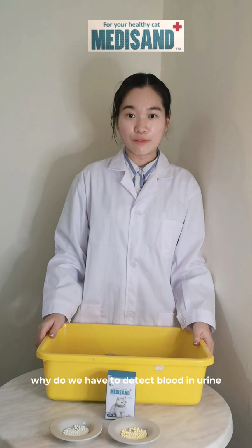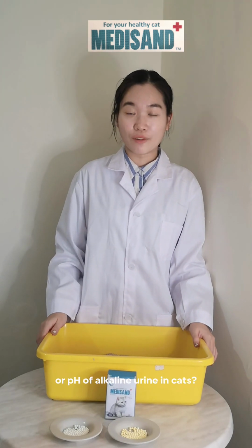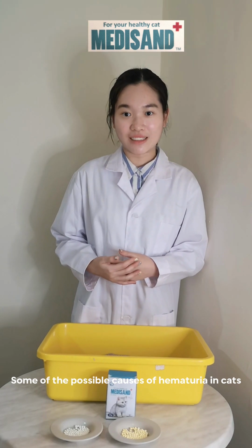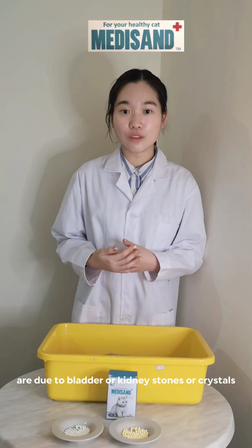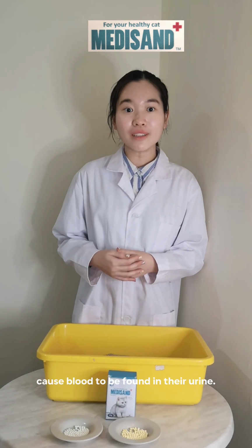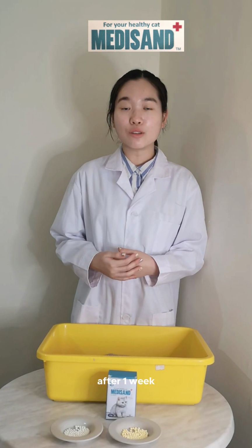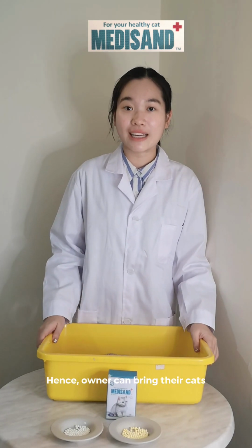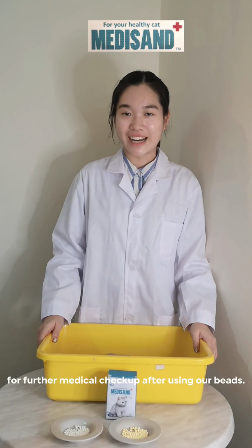First things first, why do we have to detect blood in urine or the pH of alkaline urine in cats? Some of the possible causes of hematuria in cats are bladder or kidney stones or crystals, which cause blood to be found in their urine. Certain cats, one week after being neutered, still have blood found in their urine, hence owners can bring their cats for further medical checkup after using our beads.